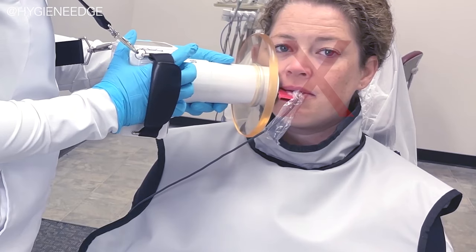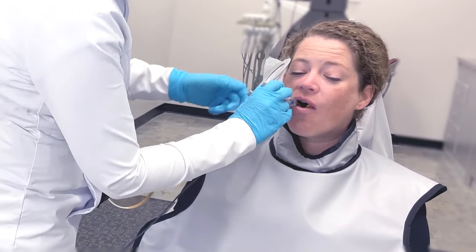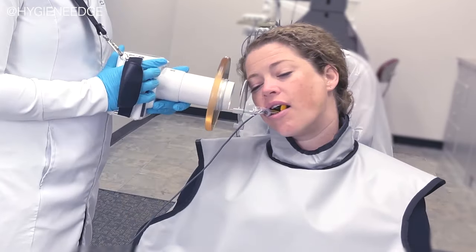Have the unit within two inches of the target without actually touching their face. If you use XCP kits, use one with a short metal rod to get as close as possible.